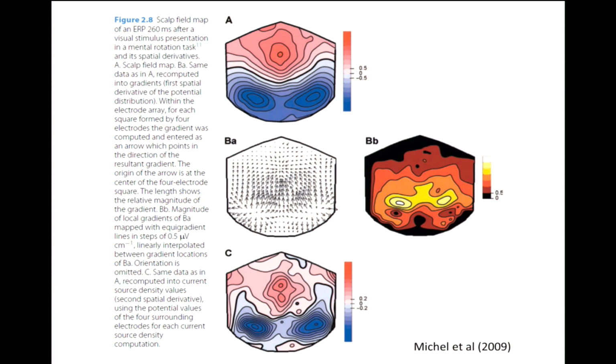That's an advantage, but the second point is a corollary of that: the electrodes at the edge don't have a very good neighborhood, because those electrodes are the boundary, and you cannot create a nice neighborhood around them. So your current source density approximation would be quite poor at the edge electrodes.